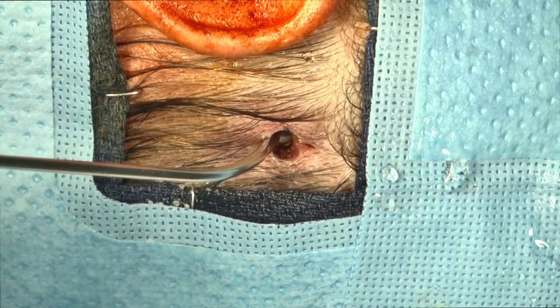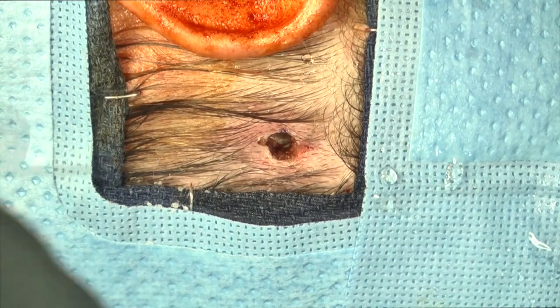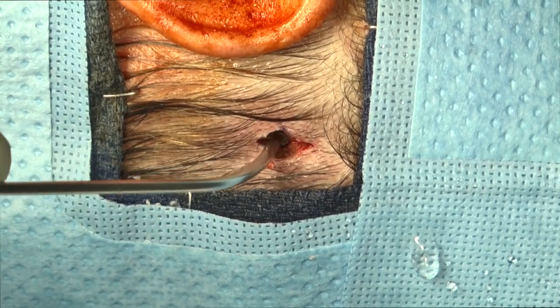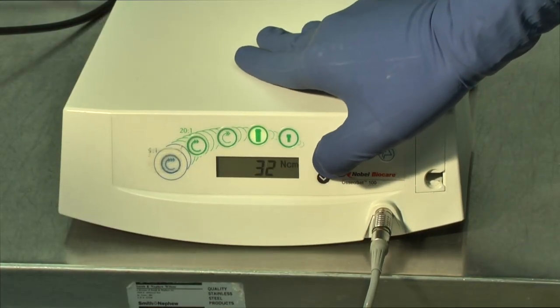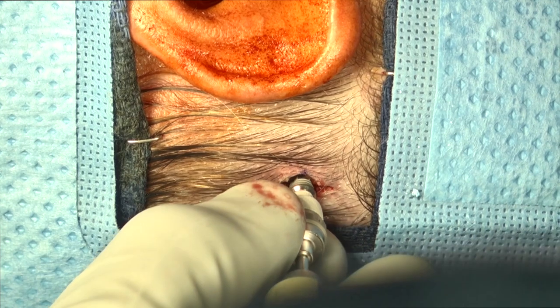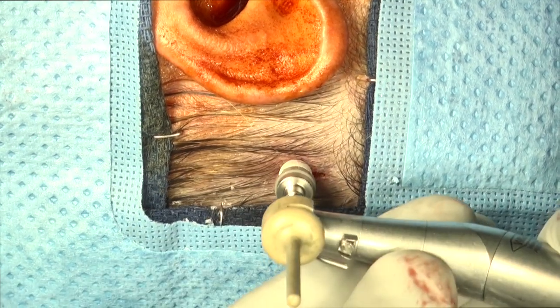Next, the surgical site is irrigated and inspected. Note the circumferential lip of bone removed on the cortex from the second tier of blades. Next, the drill console settings are changed for implant placement — this is on a slower speed at a setting of 20 to 40 newton centimeters depending on bone quality. The fixture and abutment are attached to the drill and placed at a slow speed between 20 and 40 newton centimeters.